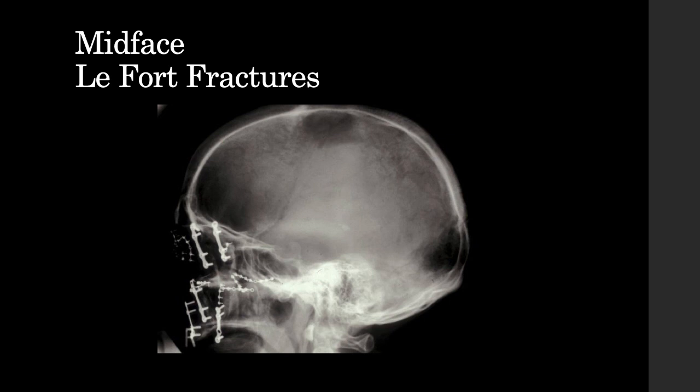So for the Lefort type 2, it's the same sort of fixation, but they also put plate fixation on the infraorbital regions. And then for the Lefort type 3, it's the same again, but they also do frontozygomatic repair, frontonasal repair, and repair the zygomatic arch as well, to make sure that not only is the jaw occluding well, but the face is actually attached where it should be.